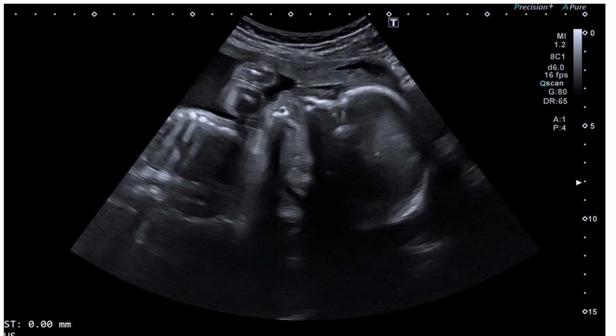Hello, how are you? So in this presentation, I'm going to show you fetal breathing. Some of you have seen it, some of you are yet to see it. So today I want to show you how a fetus breathes inside the womb.